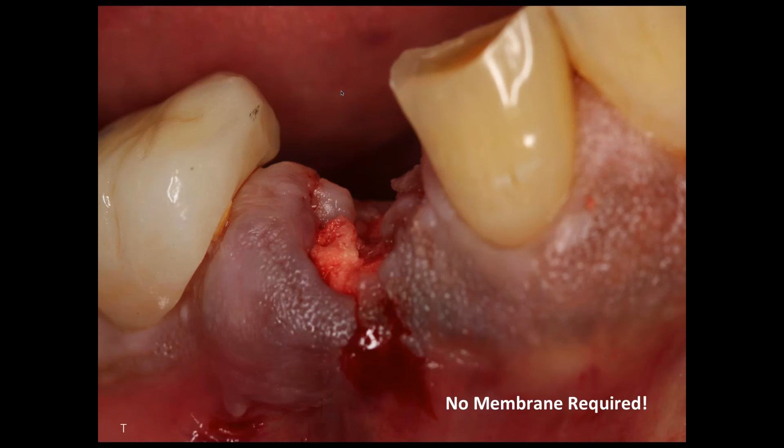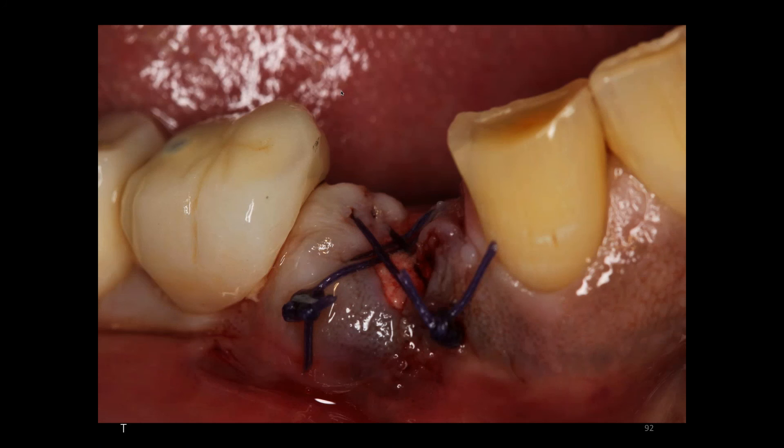This is what the socket site looks like immediately after placement — you can see it's radiopaque. But over a period of time, in four months or so, you can see how that socket starts to heal. It heals from the apex, going up to the crest.